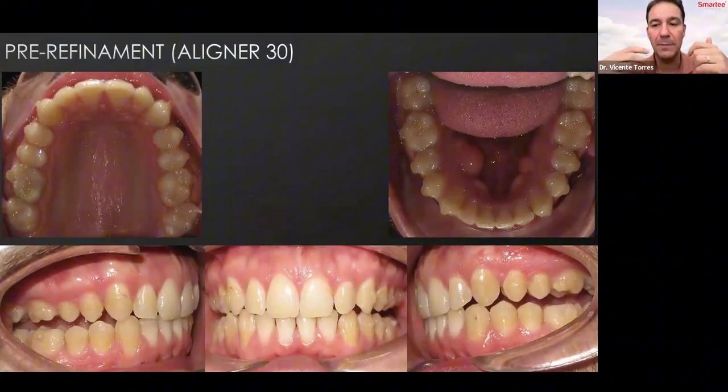Of course, the patient is not comfortable, but I always explain from the beginning to the patient: you need to use it during meal time. From the beginning, you are not going to feel comfortable, because eating with the bites is not like that. It's not comfortable, but in the end, it's only a problem at the beginning.